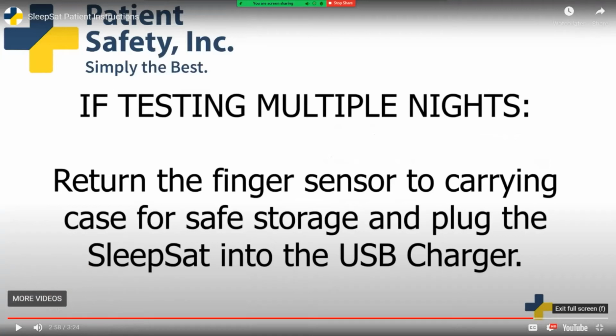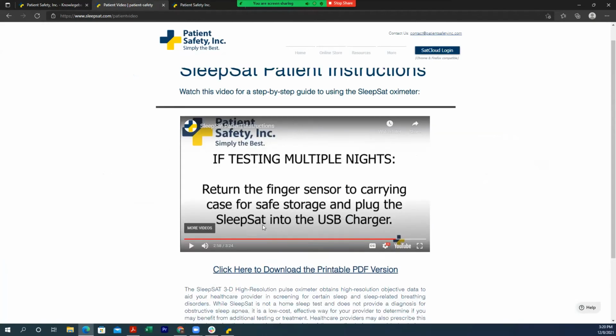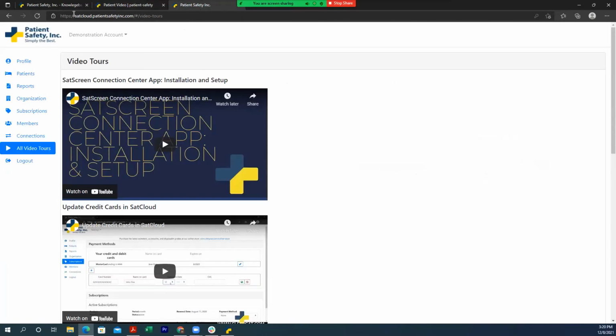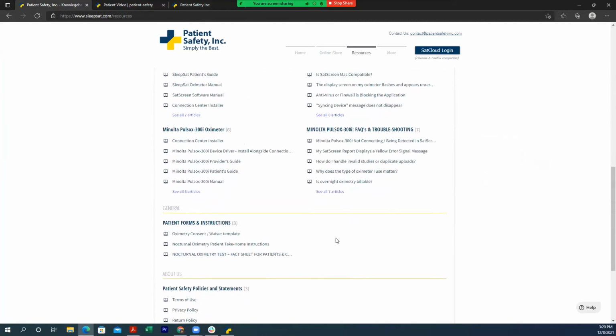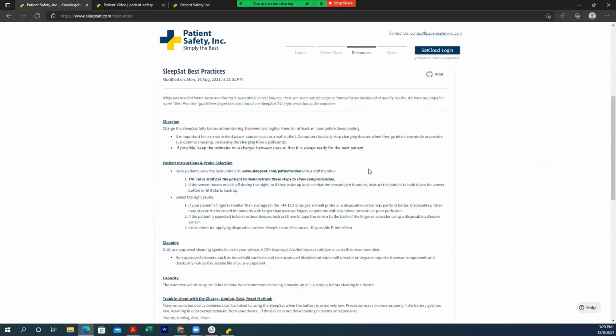All right. The rest of that goes through just the process of bringing the unit back. I have overrun a little bit, but I do want to go through the best practices document and then again review Daphne a little bit and some of the features it offers.